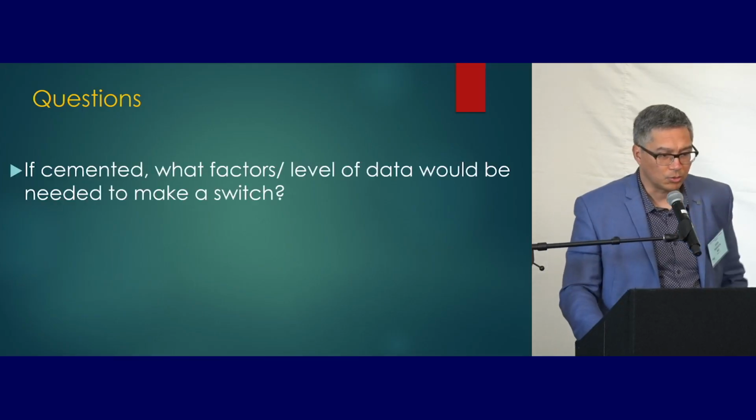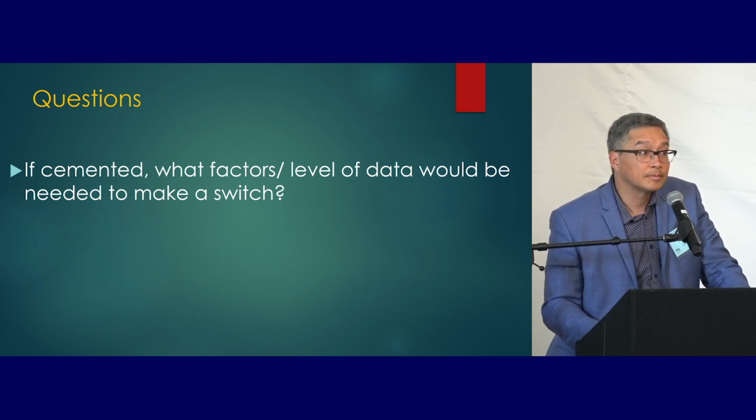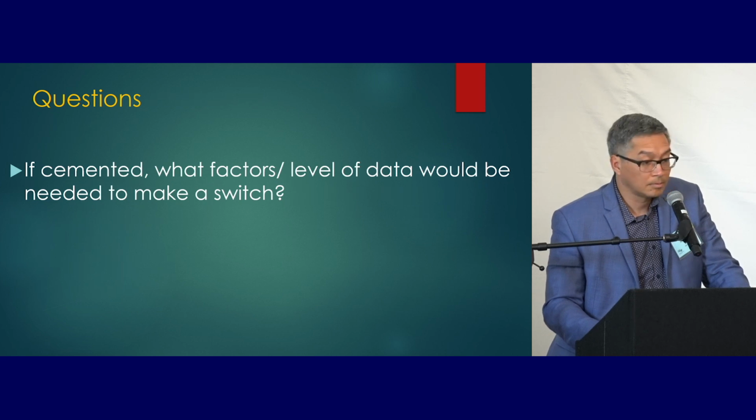All right, some additional questions. So for Alfred, what factors or level of data would you need to see to make a switch? Honestly, I've got probably unrealistic expectations. So long-term outcomes, so 20 years, cost, data to justify it, and also some unbiased, if that's possible, analysis of qualities based on PROMs.